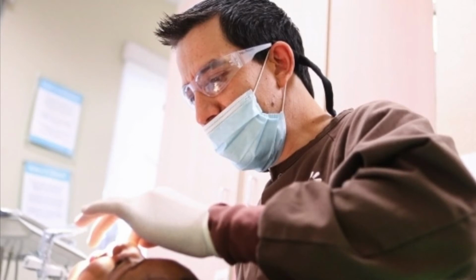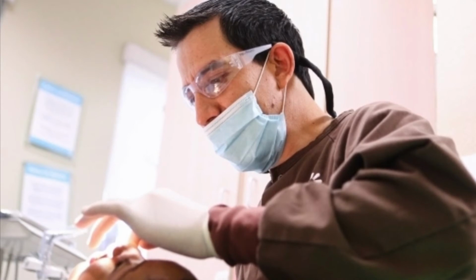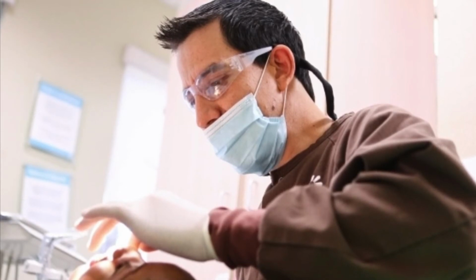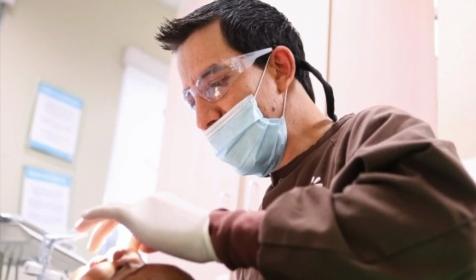Again, know the average length of each tooth. Place the file selected to be the correct initial width into the canal, with its rubber stopper set at the estimated working length.